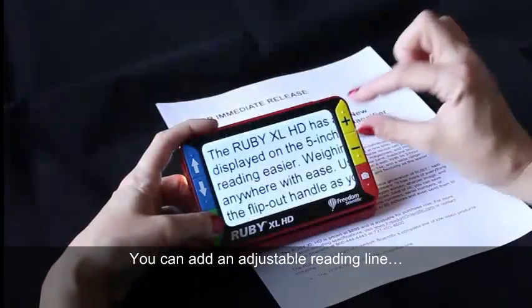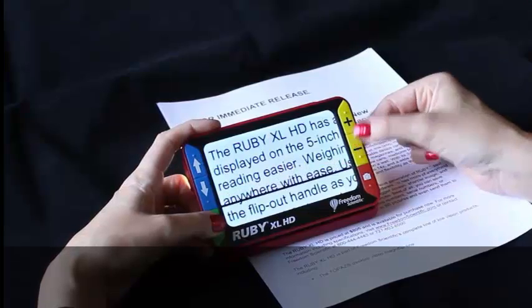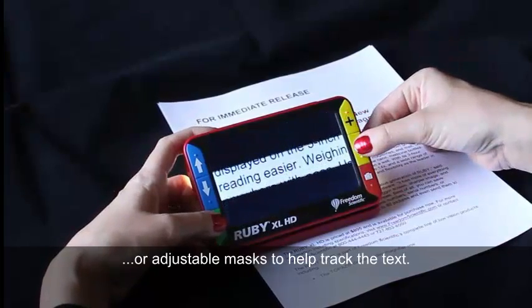You can add an adjustable reading line, or adjustable masks to help track the text.